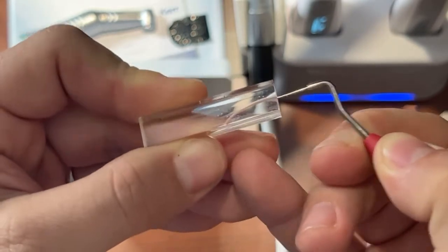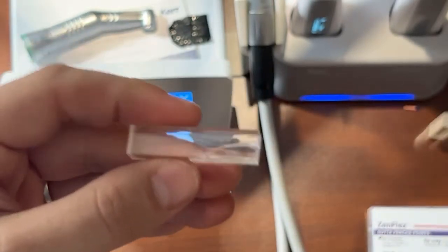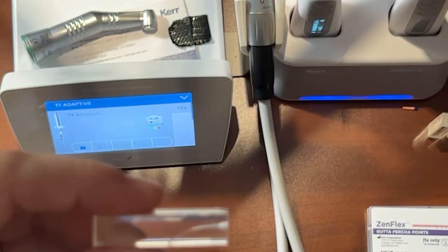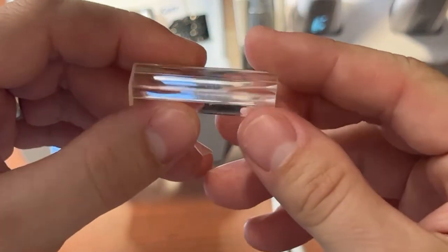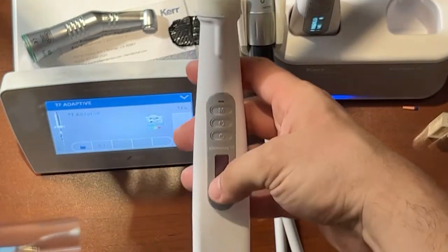This is warm vertical condensation, folks. It's the best way to do a root canal. So now we've got that beautiful plug. And if you're going to do a post here, you would be done.